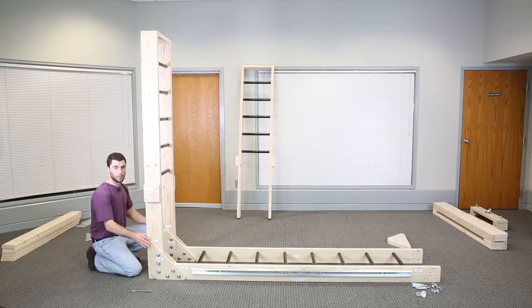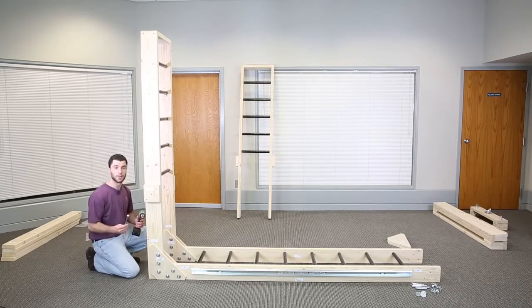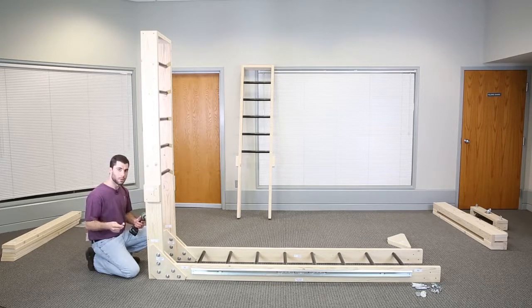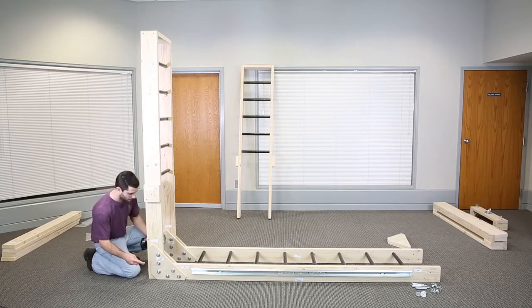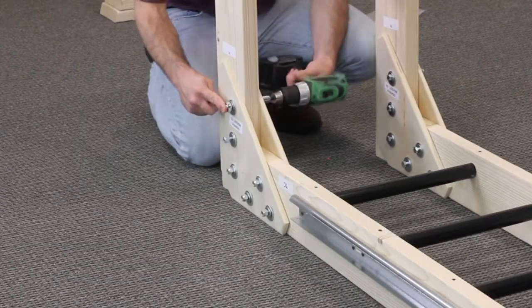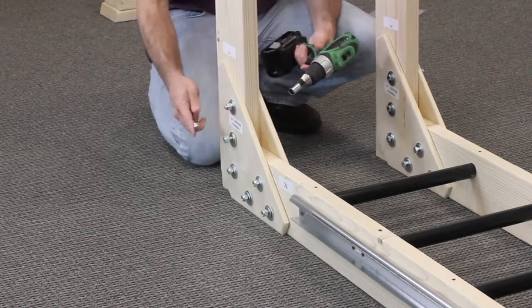Once all the bolts on both sides of the ladder are in place, you can tighten them down completely. You can do this with your power drill and a 9/16 wrench, or if you choose to do it manually, a 9/16 socket with a handheld socket driver and a 9/16 wrench. Again, for speed, I'm going to do this with the power drill. So just place your wrench on the bolt and tighten down until it seems to be a snug fit.